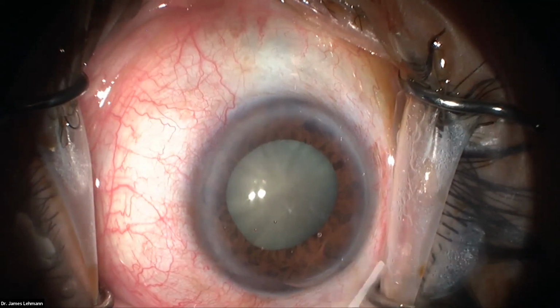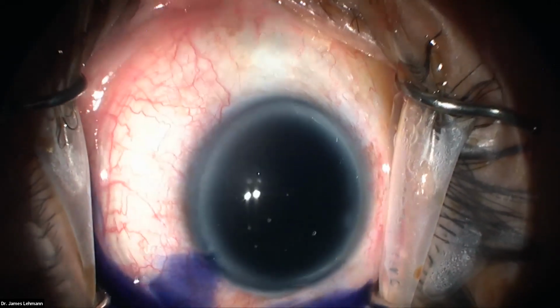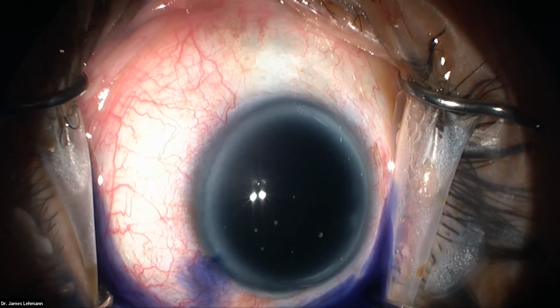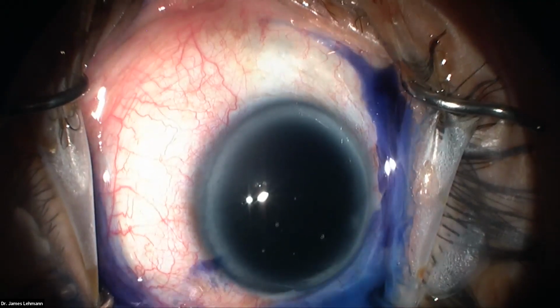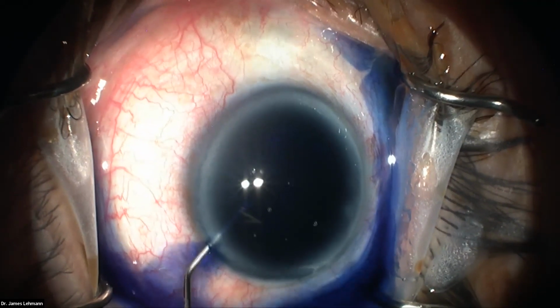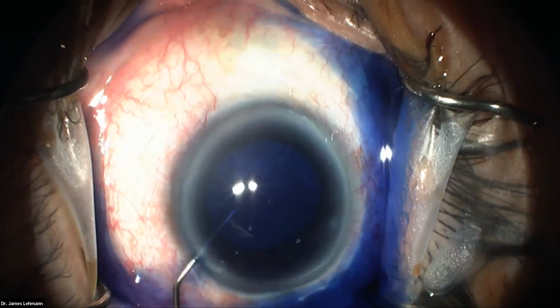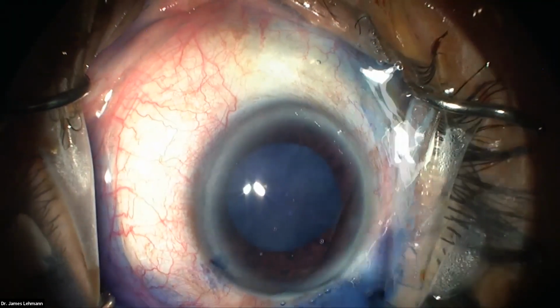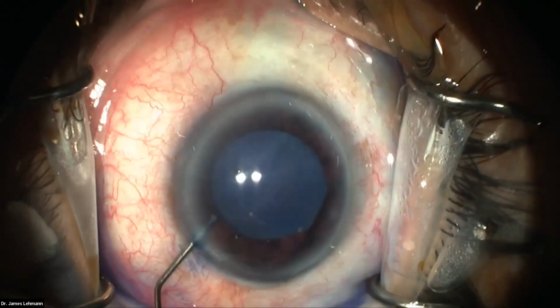So this is the vision blue or trypan to stain that capsule. And then you don't have to put any air bubble or anything in there. I know they had that on the last case, but that was just kind of an accident because there was a bubble in the cannula. You just want to let it sit for a little bit, and then we're going to rinse it out. This also helps mark your paracentesis. You'll see after I withdraw this cannula that paracentesis is nicely marked. And then just to be neat, I want to get some of the hair off of the rest of the eye. So you can see the paracentesis is very easy to see there.